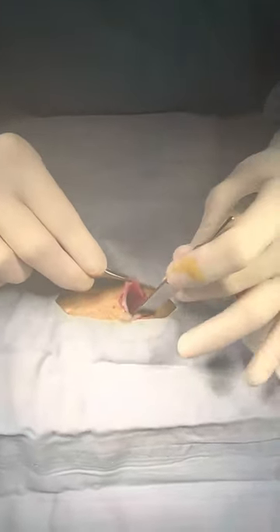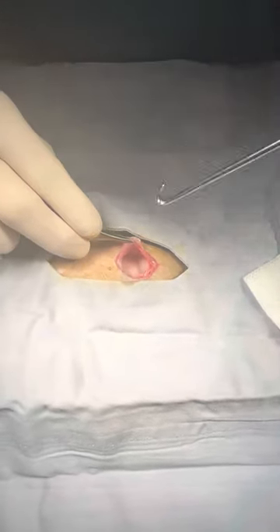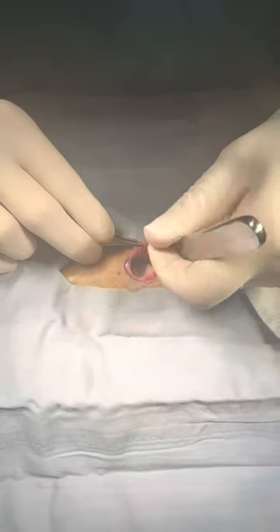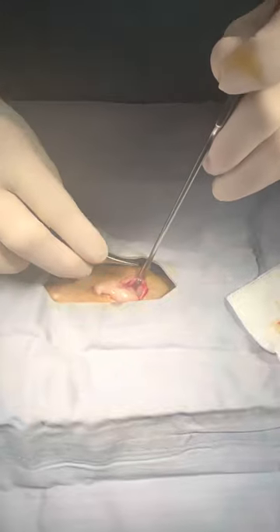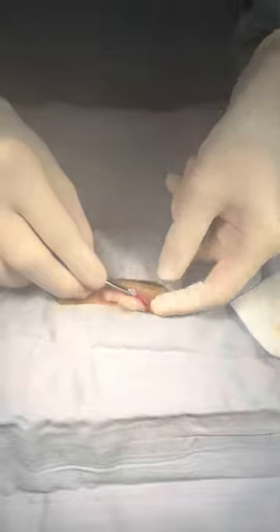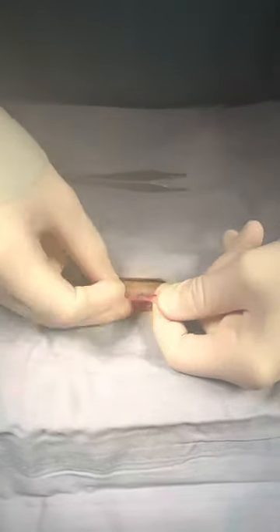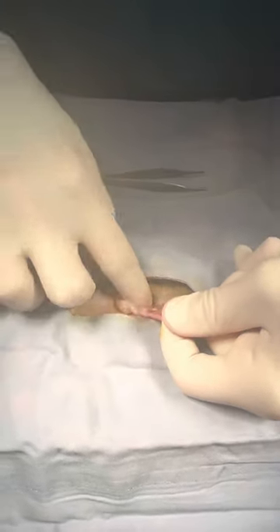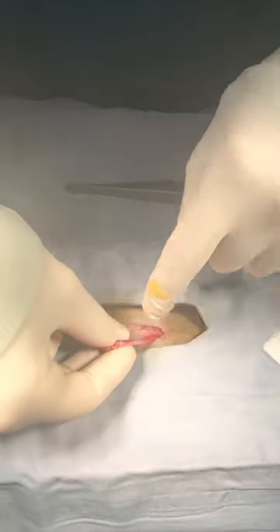The first thing you see when you look in the abdomen in this cat is a fair amount of fat — not a huge surprise because we already saw that she had a fairly large amount of subcutaneous fat. We use our spay hook to go ahead and pick up the uterus. The uterus in a cat is quite a bit different than a human, though it is very similar to a dog. In my hand here is the horn of the uterus, and her ovary is right here. In this surgery we're doing an ovariohysterectomy, so we're going to remove both the ovary and the uterus.